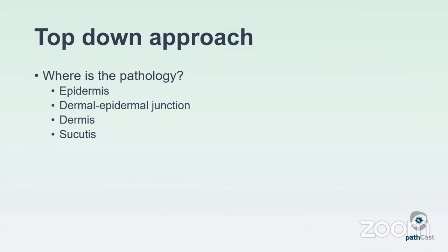The most important thing I would say when you're first starting to learn derm path especially is taking a top-down approach. I always encourage my residents to do this because when you first look at a slide, it might be a little bit overwhelming. Where do you start? What to look at? A lot of times people default to immediately trying to look for the pathology and to describe it. Don't do that. Take a layered approach.